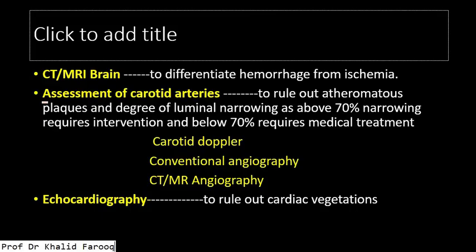examination for final year, we usually see that examiners present CT, so we will stress on CT images in the present discussion. So we have to use either CT or MRI, but in the present discussion we will use CT examination.